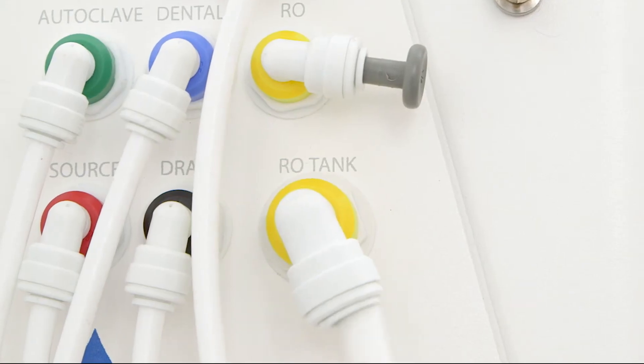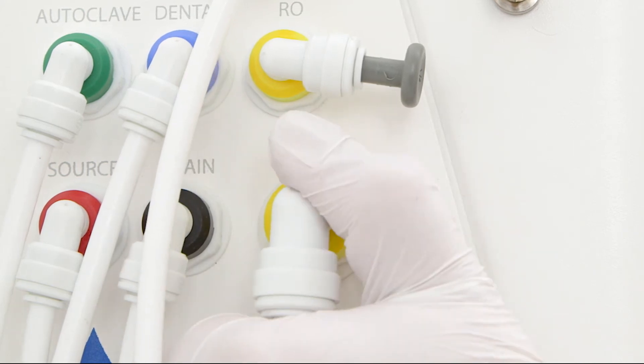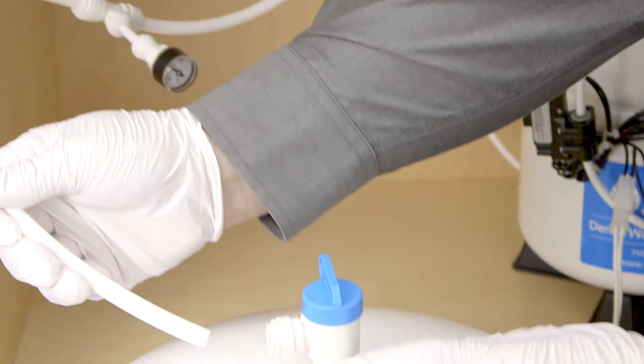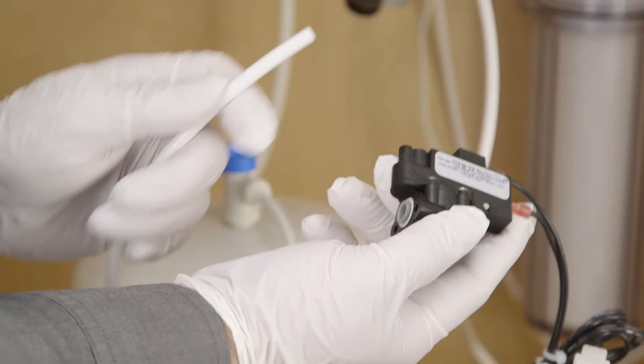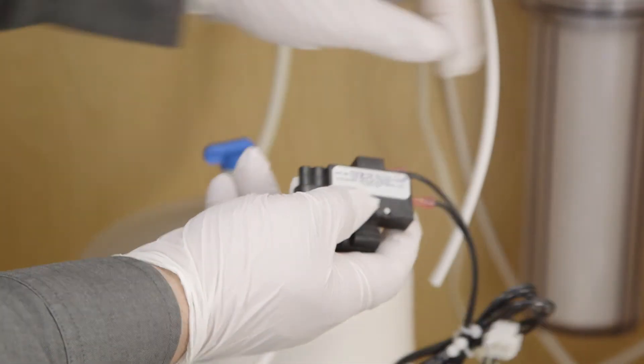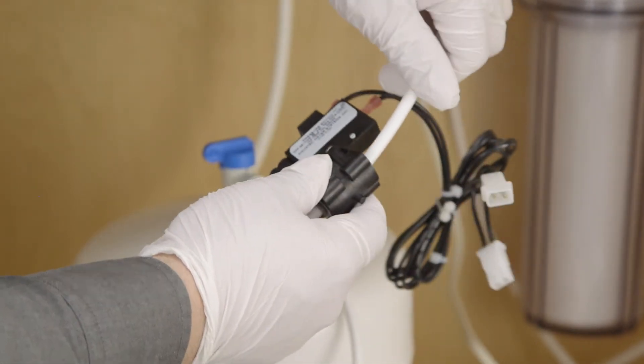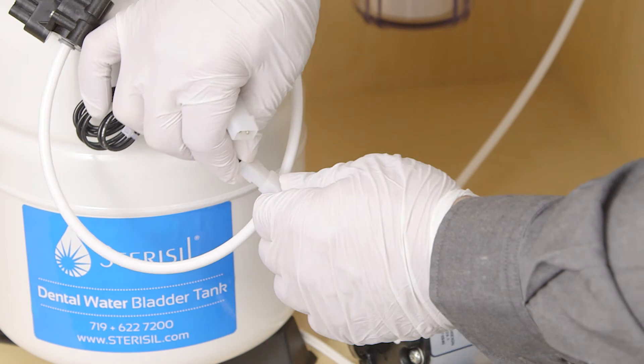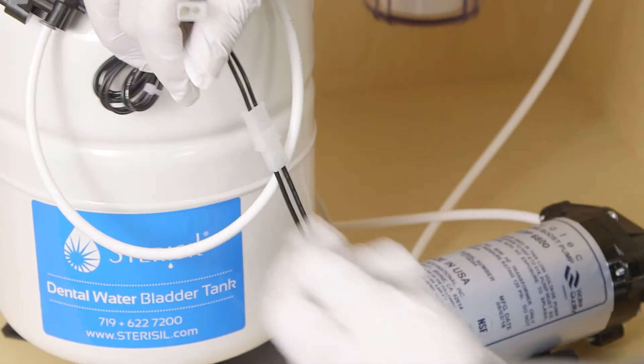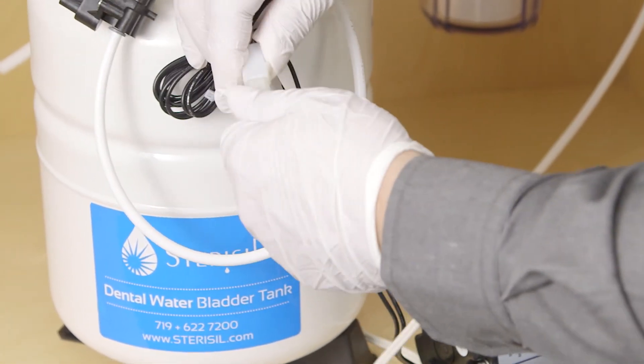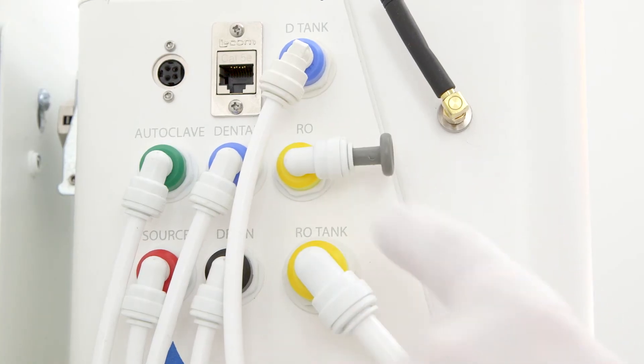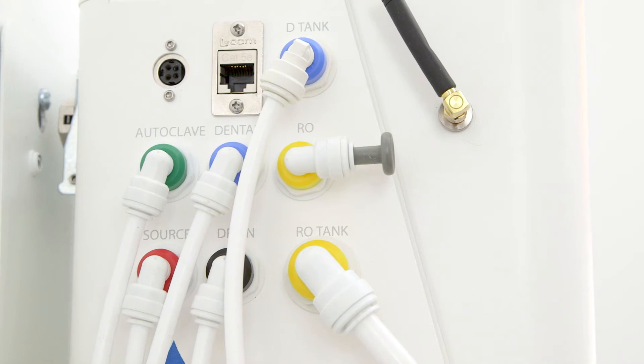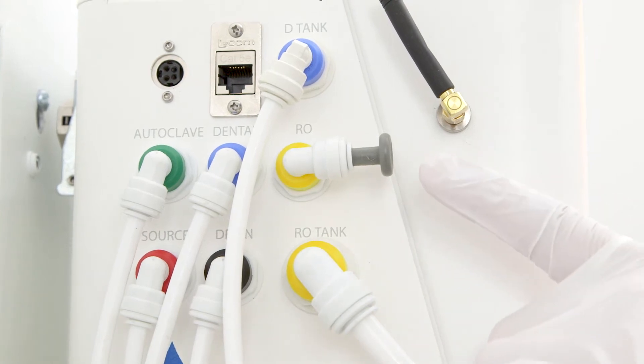RO tank port. Run a 3/8 inch line from the RO tank port on the system to the 3/8 inch tank ball valve on the RO water storage tank. The pressure switch for the booster pump must be installed on this section of tubing. Make sure you have enough length on the power cable to reach between the pump itself and the section of tubing with which you intend to merge the pressure switch. You'll now be left with a yellow RO port. If no auxiliary reverse osmosis water will be used, then this port should remain plugged.